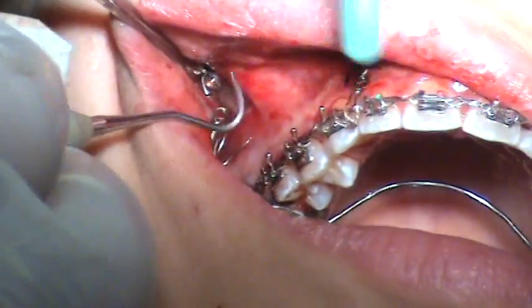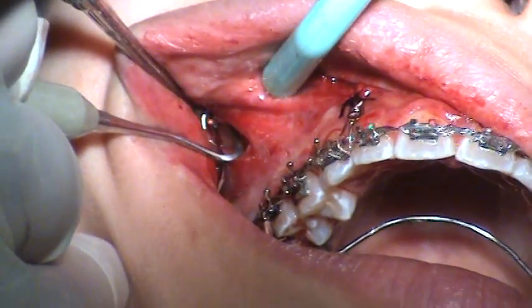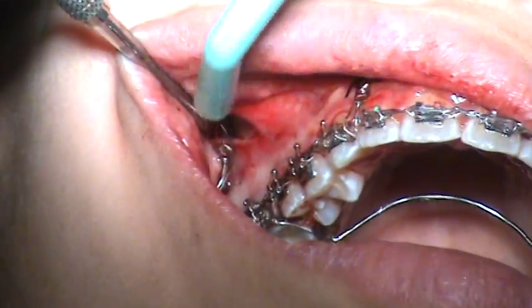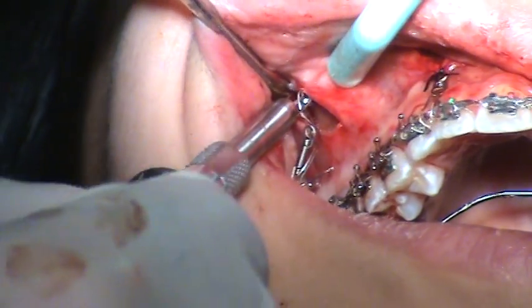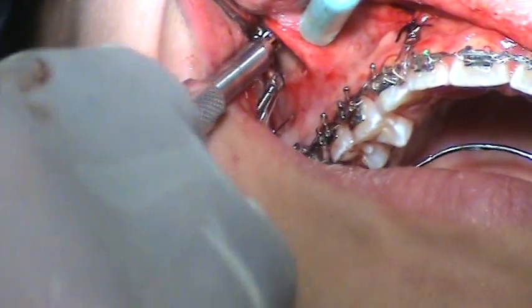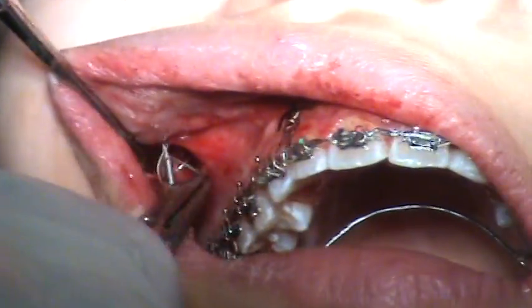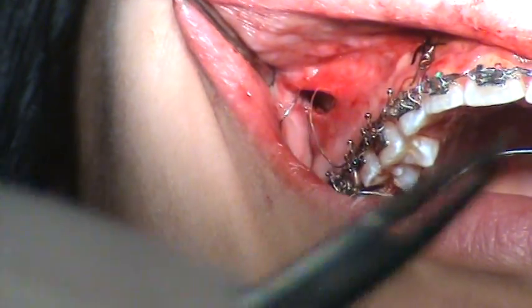I just want to make sure it's all the way up there. I'm trying to run just a little bit more. But you don't want to keep on turning — I don't want to keep on turning.